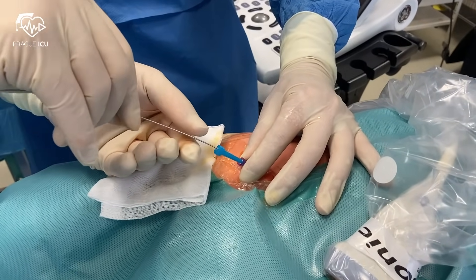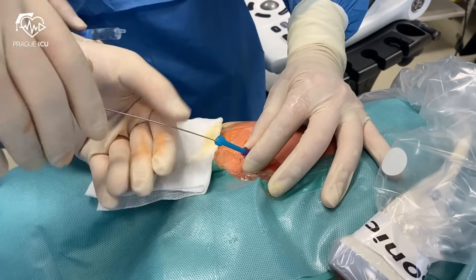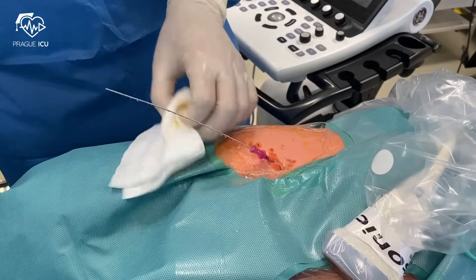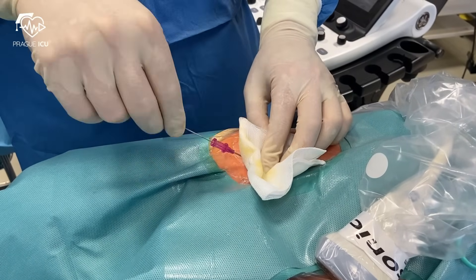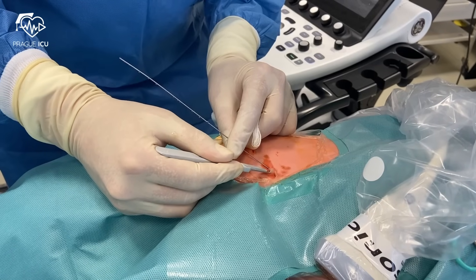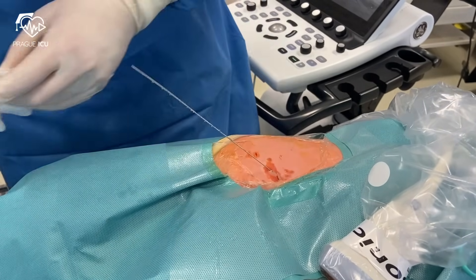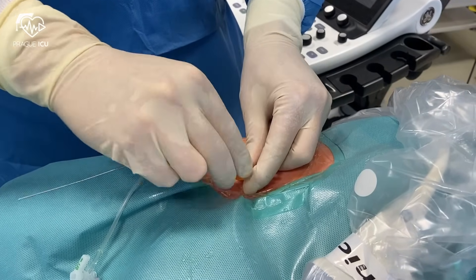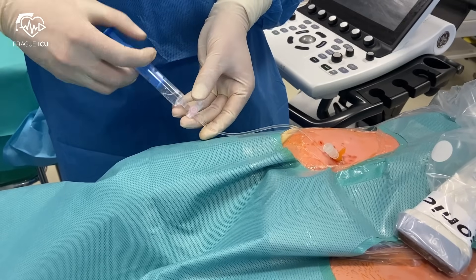After puncturing the femoral vein, insert the guide wire. Make the superficial incision at the entry point of the wire as it will facilitate the passage of the sheath. Avoid bending and kinking of the wire. Remove the wire with the introducer and flush the lumen appropriately.